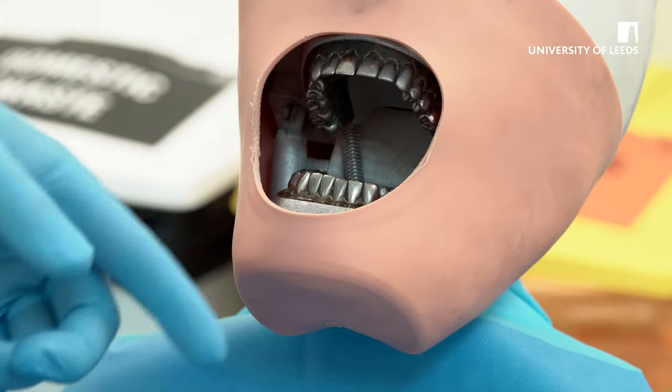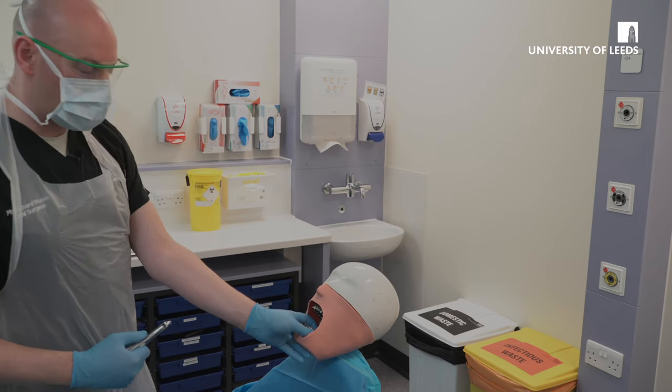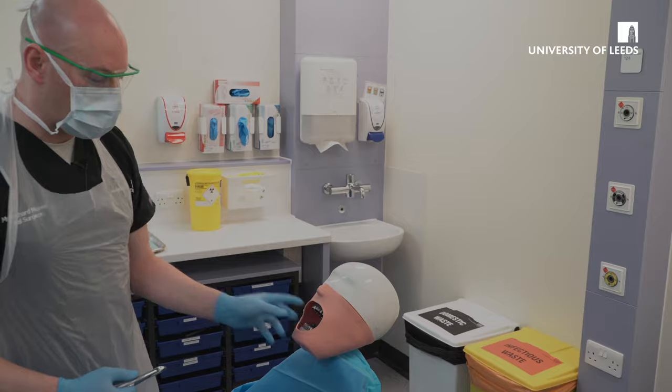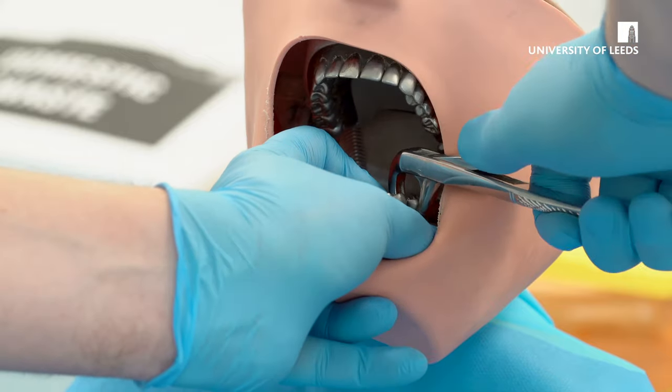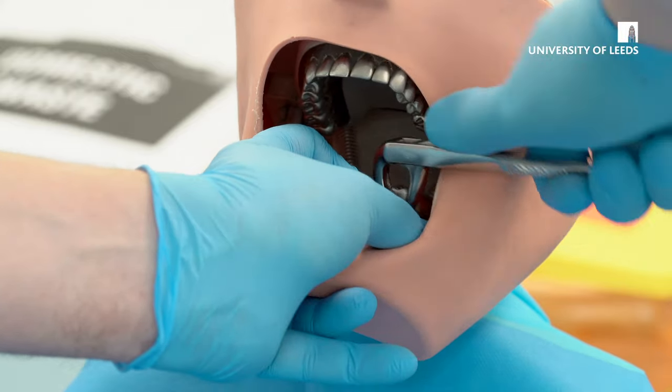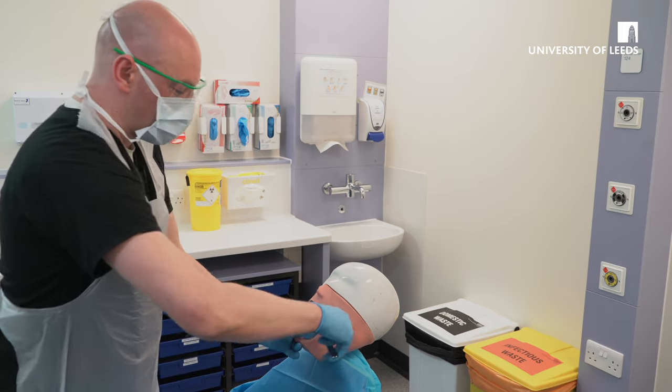To extract the lower left molars, as a right-handed operator you would stand in front of the patient, with the same principle — non-dominant hand supporting the mandible — and the forceps, ensuring they're on the correct tooth, drive them down with a figure-of-eight motion, and deliver the tooth buccally. Check the apices and squeeze the socket, ensuring haemostasis.